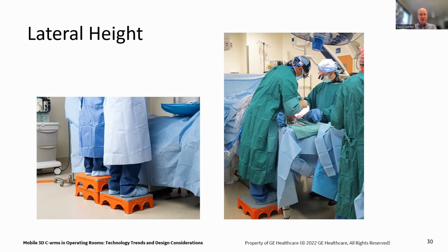There's a lot of studies on the ergonomics and the problems of trying to do this, and how the doctor's position minimizes the usefulness of the system if they don't have their neck in the right spot, their eyes aren't looking the right way, if their elbows aren't in the right location. Now, that's not to say that everybody in the room can get away with having a lateral height and making everybody happy, because everybody's different heights. But certainly, if you're trying to get the best outcomes, you don't want a system that's going to compromise the doctor by saying, sorry, this is what you have to do. You really want it to be under the doctor's control to say, the system is where I want it to operate on this patient, and I can get it at the height I want.